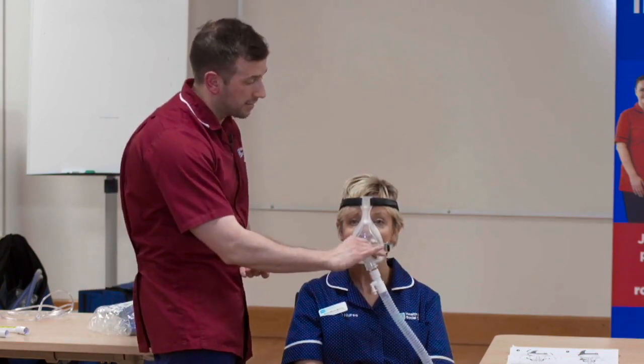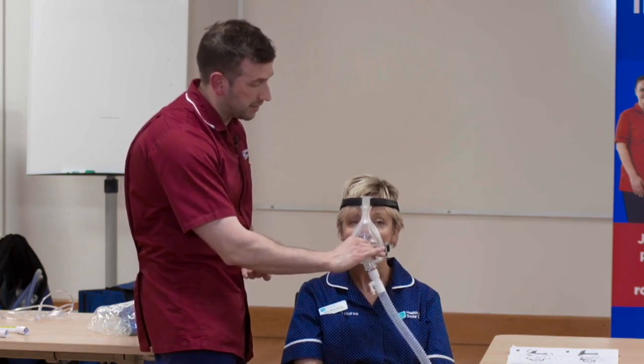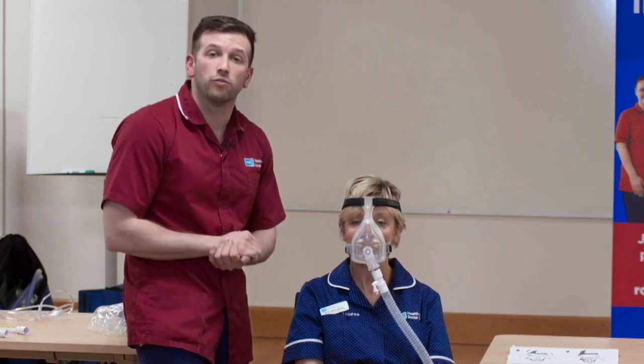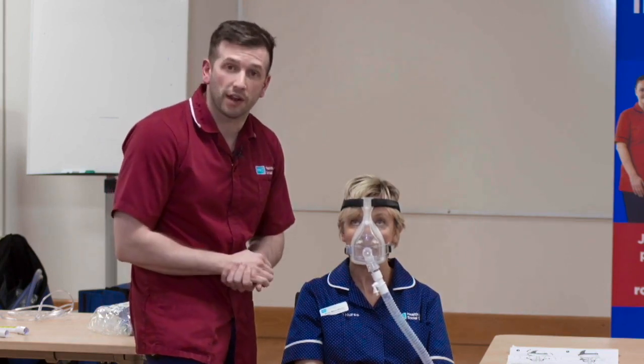Take the elbow of the mask and just give it a little bit of a toggle to see that it's in place and that it's secure. It's at this point we're ready to switch on and start the therapy.